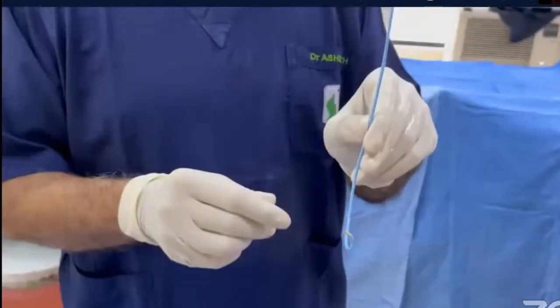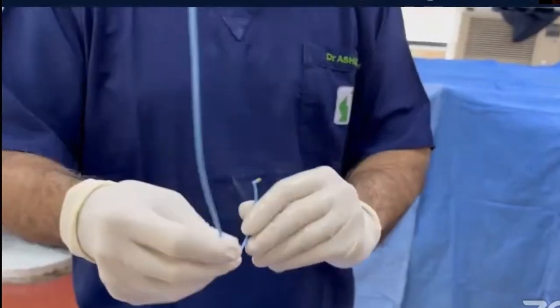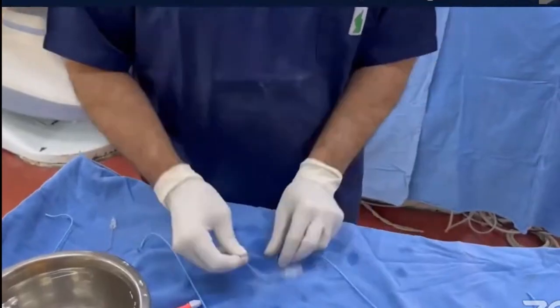Femorals are preferred, though, by the way, there are some publications related to using radials and how anomalous right coronary artery, which arose close to the left main, can be done more easily through radial than with femoral. Now, whether that is really true, because that's a couple of publications related to that, I can't comment to that because I would never chase an anomalous right through a radial. I would always do it femorally, as you watch me do.